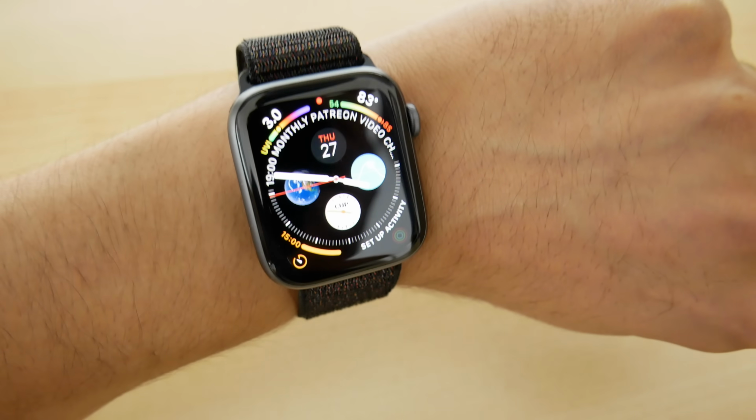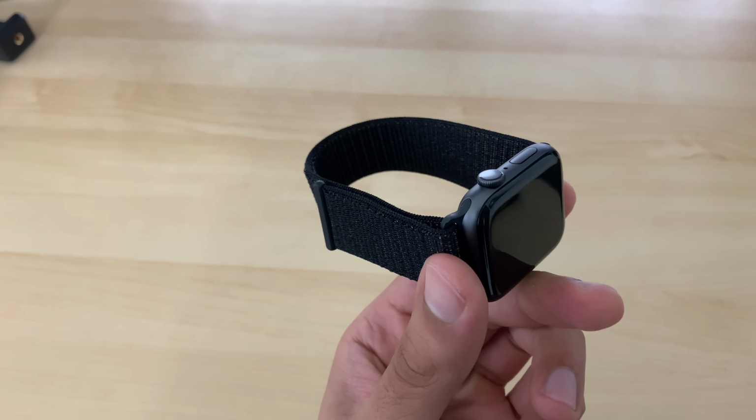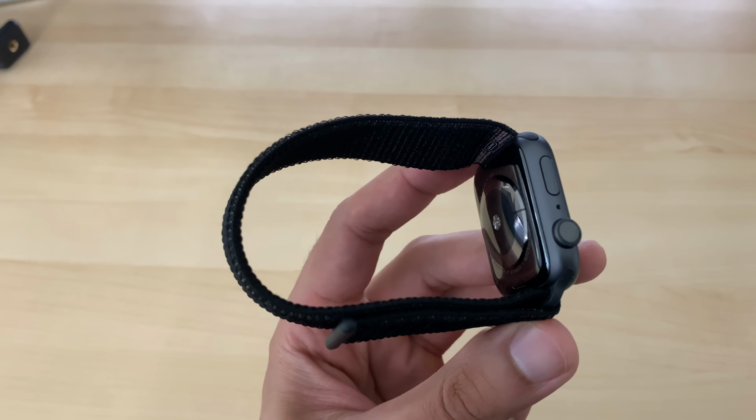So where does the Apple Watch fit into this? Well, the Apple Watch is essentially a lead 1 ECG. The first electrode is the ceramic back on the actual watch body, and the second electrode is the crown, which you touch with your opposite hand's finger. Now, this lead 1 is very effective at measuring the rhythm of the heart, and that's why this is such a good fit for detecting atrial fibrillation.